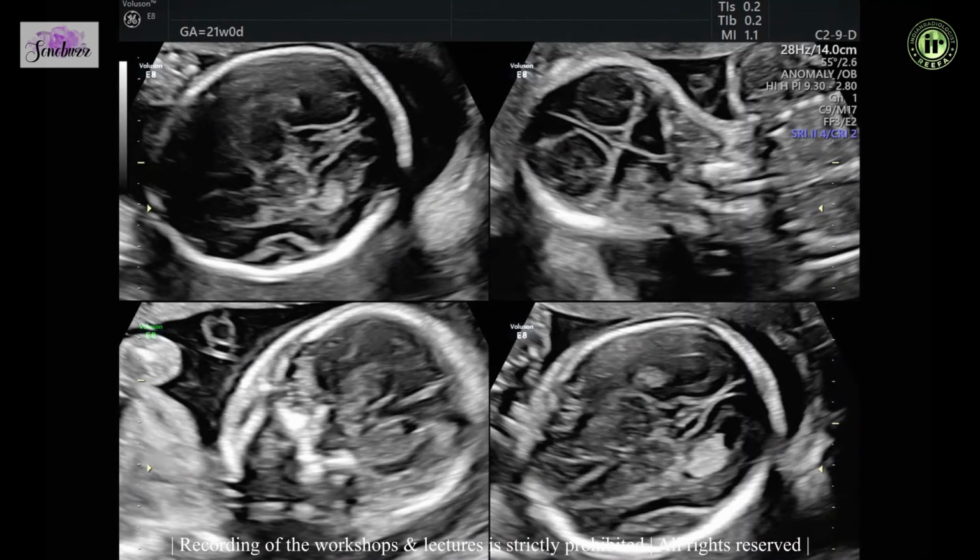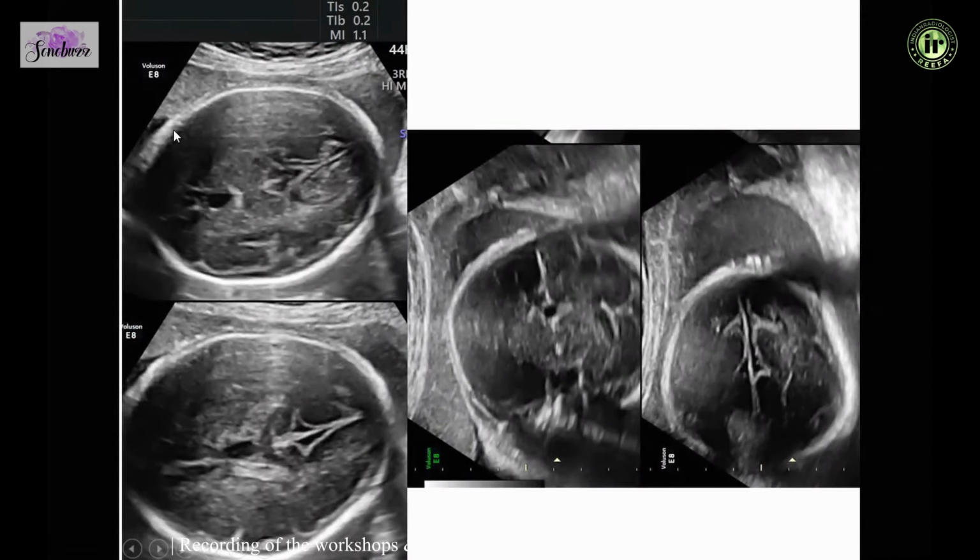It's a useful view to see the Sylvian fissure and sulcus here. And this is at about 21 weeks. You can see that the fissure is obtuse. So also in the coronal view, you can see it here. And as the fetus goes on to about 28 weeks, you can see that the sulcus has closed. It's acute, and even on the coronal view, it appears like a Y sign. So it is completely closed here.